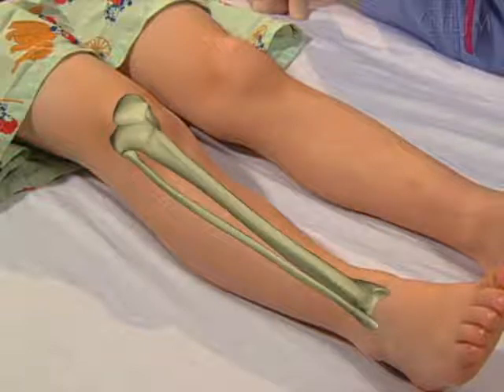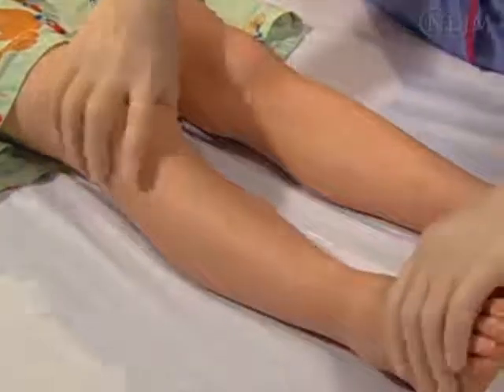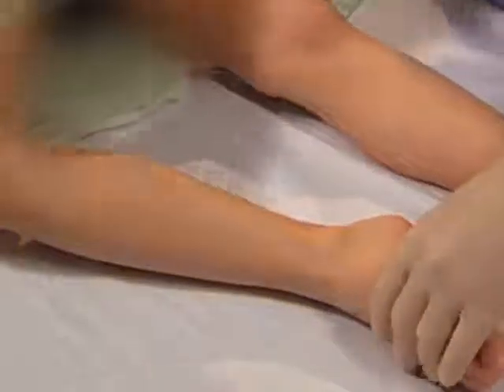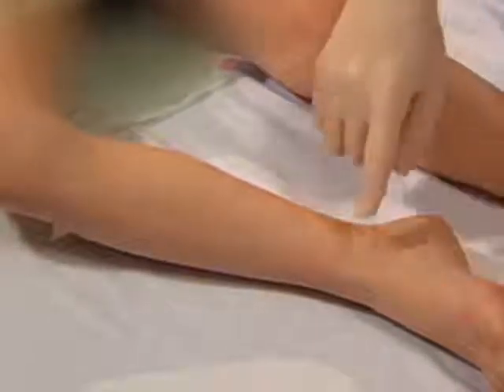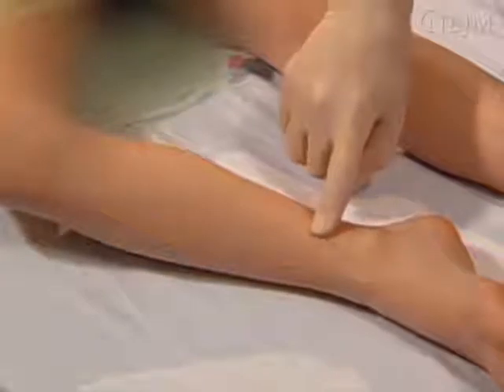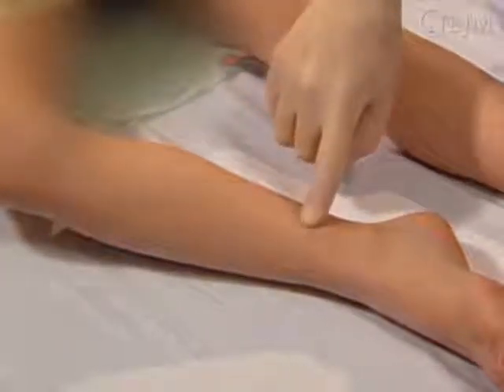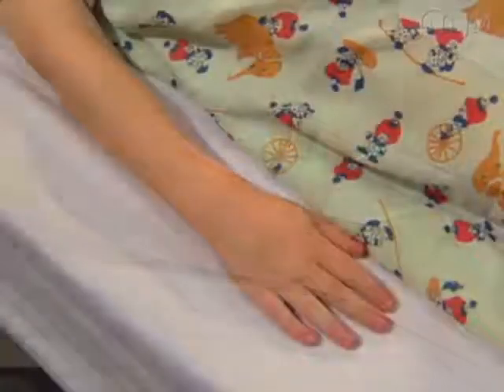The distal tibia has easily palpable landmarks in most patients. It has less cortical thickening than the proximal tibia, so it is preferred in older children. Place the hip in a frog leg position to expose the distal tibia. Identify the medial malleolus. The intraosseous insertion site spans the flat portion of the tibia, 1 to 2 centimeters proximal to the superior margin of the malleolus.